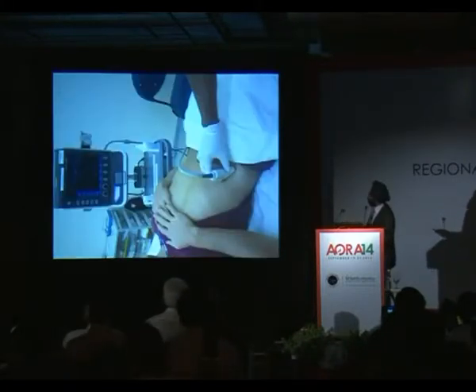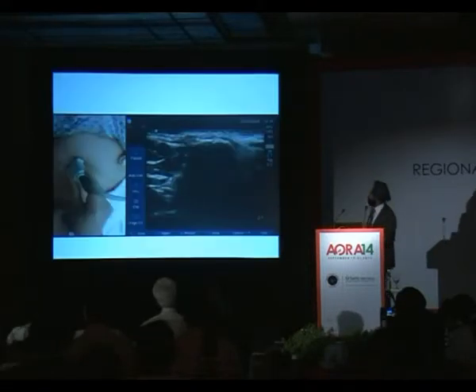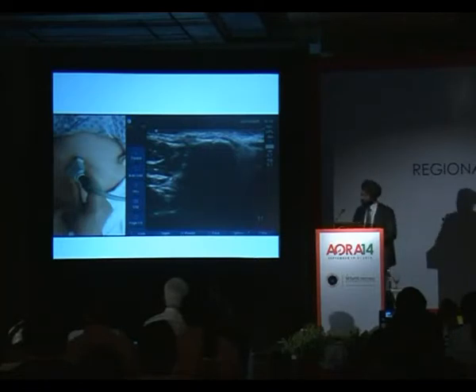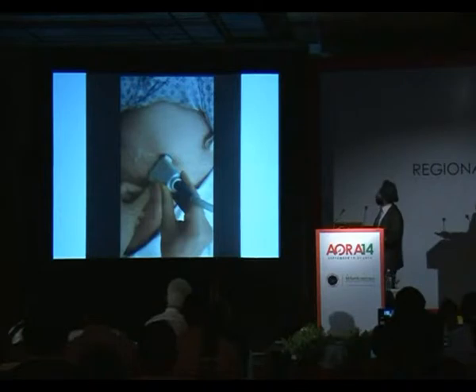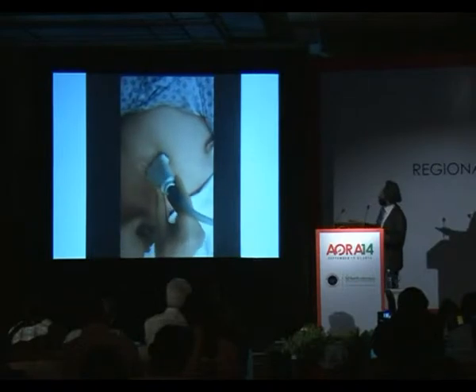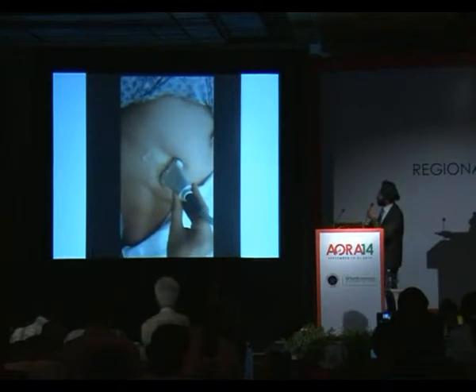So we start by putting the probe on the anterior superior iliac spine, pointing almost midway between the umbilicus and the xiphisternum. The minute we put our probe on the anterior superior iliac spine, as we would expect, you get a picture like this because the bone is very superficial. And all we need to do now is just slide the probe towards the pubic tubercle in the same line that we had for our landmark technique. Let's have a look. So all I'm doing is just sliding the probe towards the pubic tubercle on the same line for about an inch and a half.